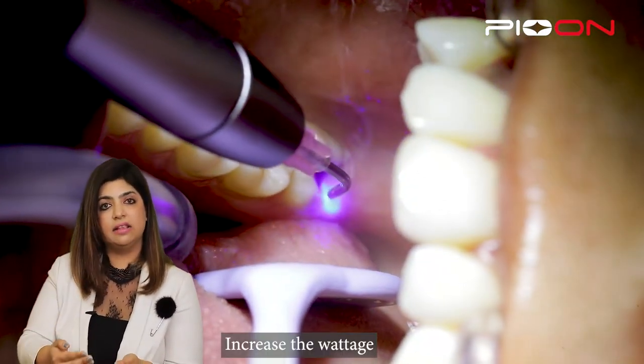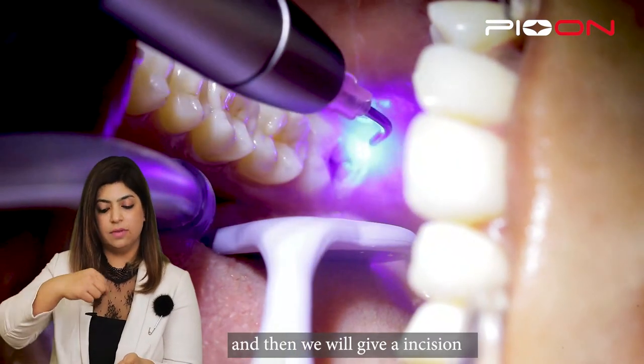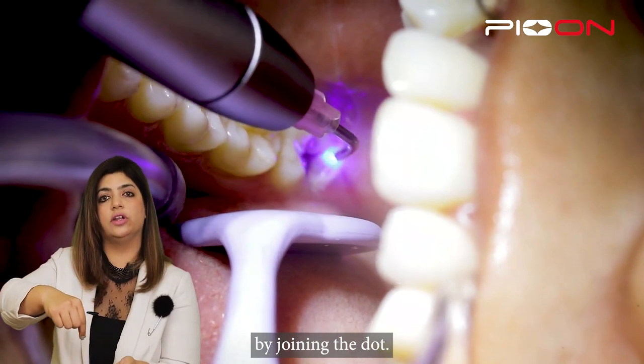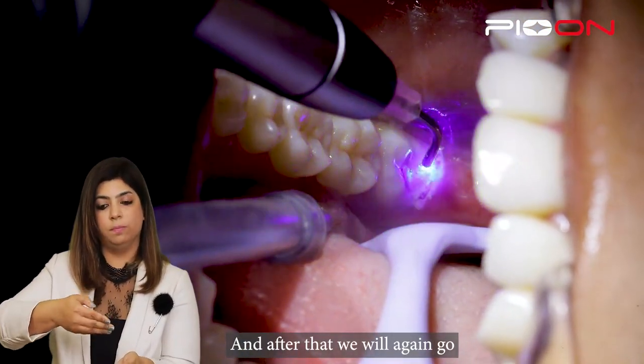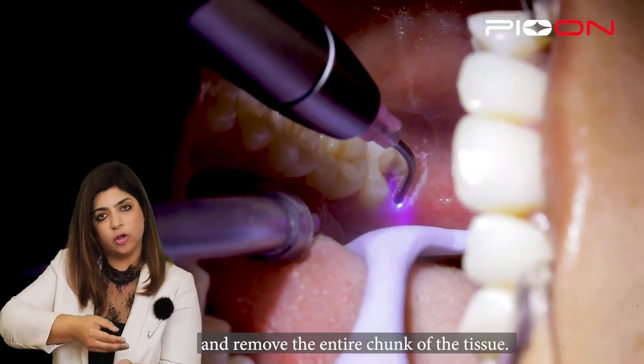Once the marking has been done, we will go back and increase the wattage to 0.9 watts continuous, and then we will give an incision, continuing to follow the dots which were given before. After that, we will go deep inside the tissue and remove the entire chunk of tissue.